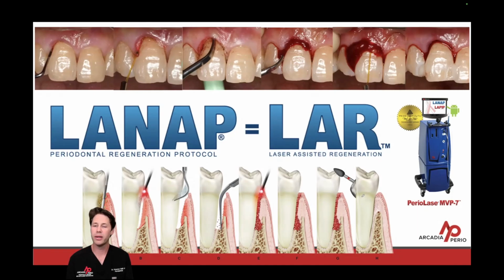Step A, bone sounding probe depths. This is important because this will allow us to determine how much energy is needed for the total case. Step B, selective ablation or selective removal of the diseased tissues and the diseased epithelium on a short pulse duration. Step C, we'll do our piezo ultrasonics to remove any subgingival plaque and calculus underneath the gum line.